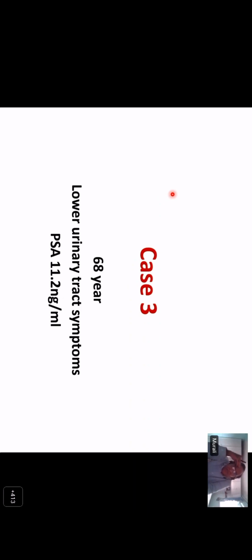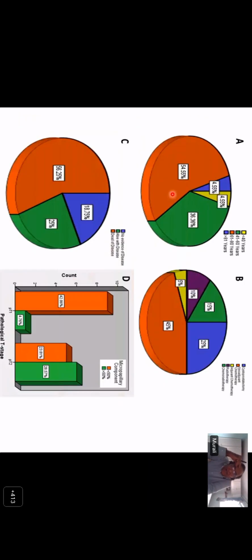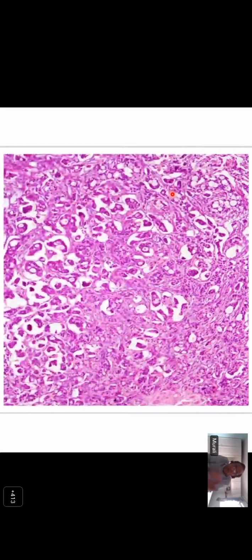And so the current recommendation is not to call it micropapillary carcinoma unless it is T1. So if you got only the surface, which is showing a micropapillary architecture, you can call it micropapillary pattern, or you describe micropapillary in your description, but don't call it a micropapillary subtype. You call it a micropapillary subtype only if that is invading the lamina propria. Yeah. Thank you, sir. Thank you for your comment.